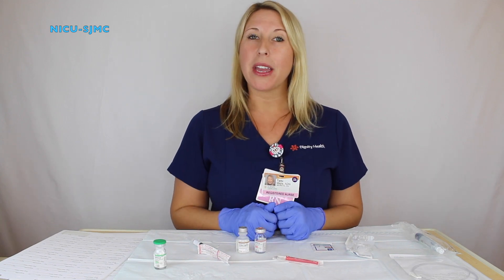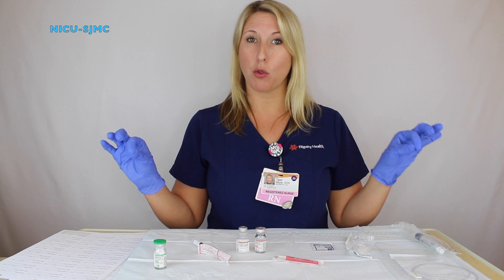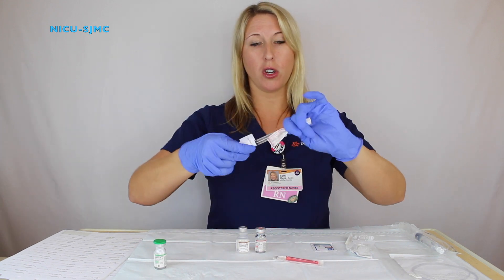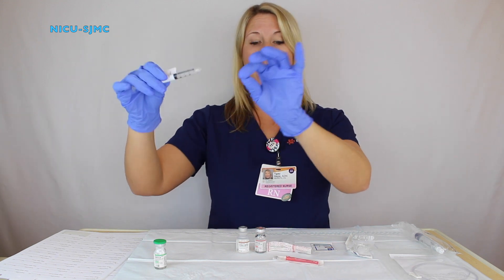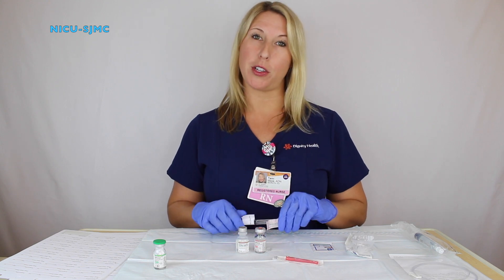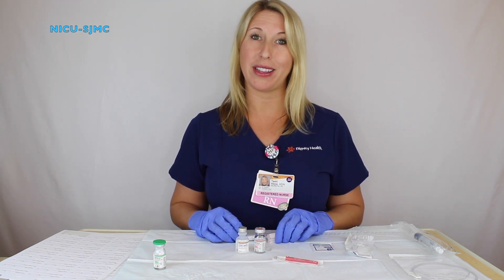When dealing with a patient who is on TPN at the time of administration, their med port line will already be pre-primed with normal saline. Go ahead and hook the syringe onto the end of the port directly. Put it on your medication syringe pump and follow the prompts to administer the ampicillin. You will need to pause your TPN during administration of ampicillin as it is not compatible to run at the same time.